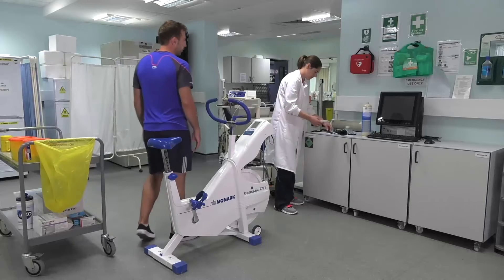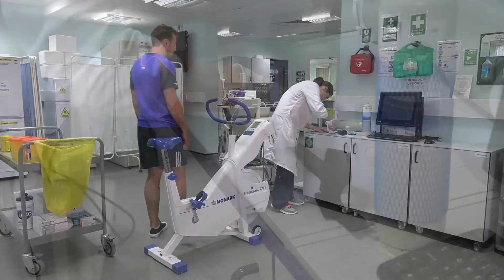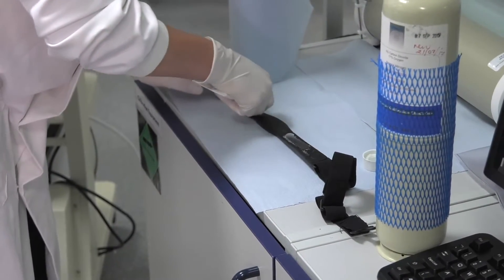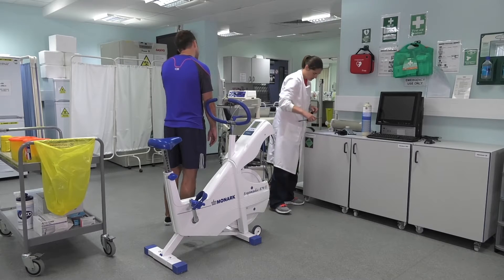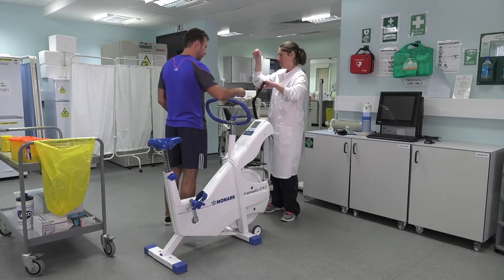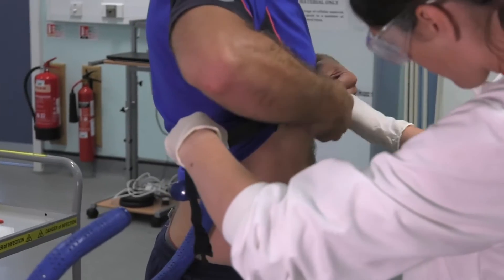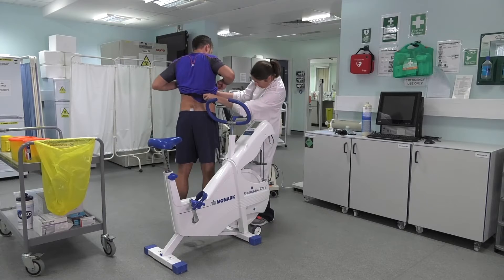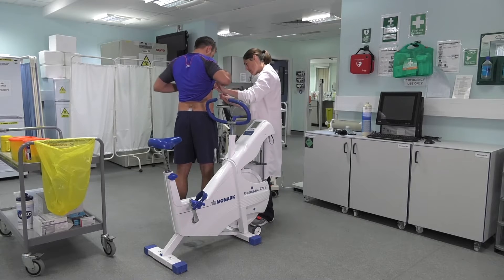The setup and calibration is shown in part one video, so here we're just going to concentrate on the test itself. Put some gel onto the heart rate monitor electrodes — ensure it's on the electrodes and not the central part. Then place the heart rate monitor over the xiphoid process on the chest and make sure that it's tight enough so it doesn't fall down, but not too tight to constrict the chest. Also make sure the electrodes are flat on the skin; depending on the shape of the participant's chest, this sometimes can be an issue.